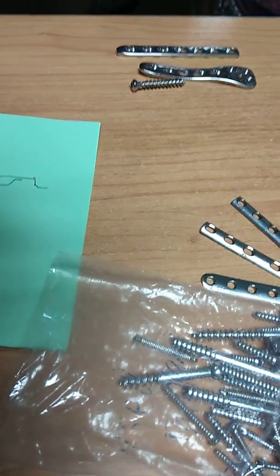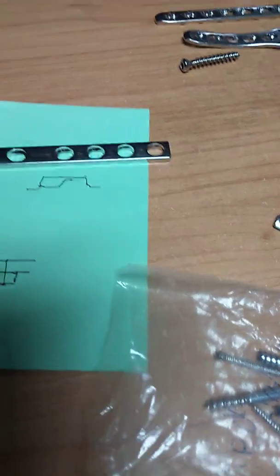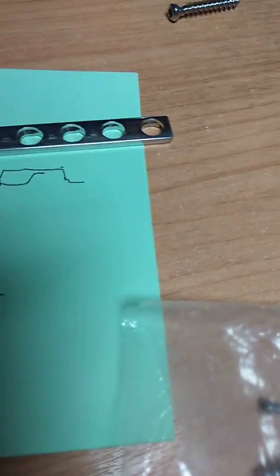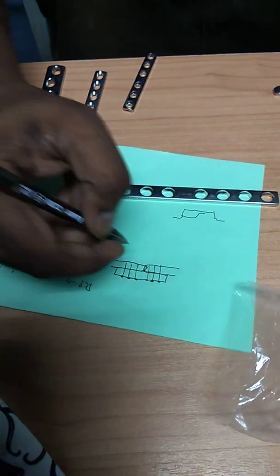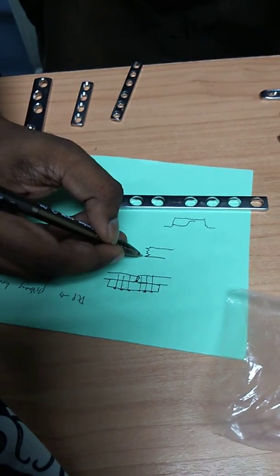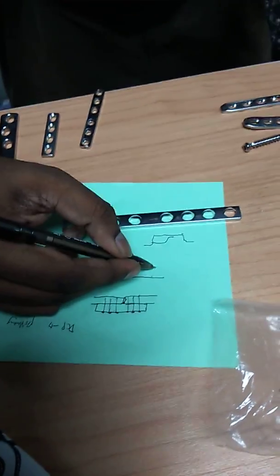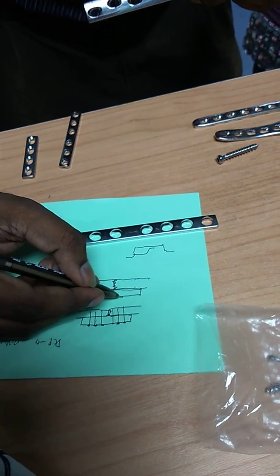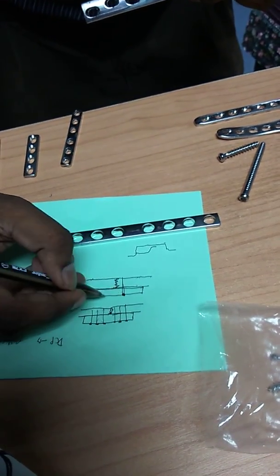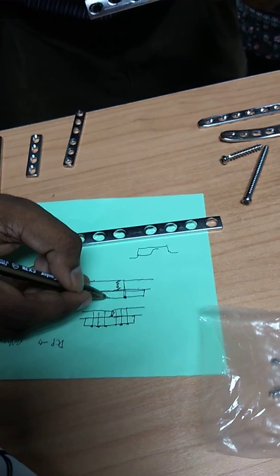So screws can be placed in a neutral manner or an eccentric manner. Eccentric manner is through the compression holes. The reason why you want to put the screws in an eccentric hole is because you want to achieve compression at the fracture site. Now you've already reduced the fracture anatomically. This is a very good reduction. So you place your plate ready, and then you put the first screw here. Then the next screw, you want to put it here.